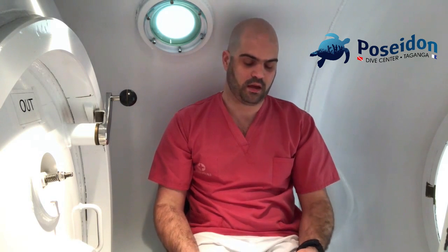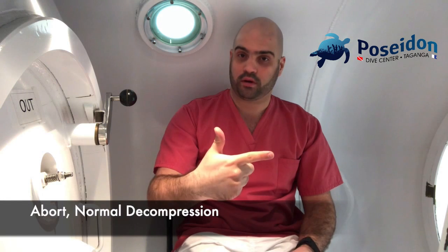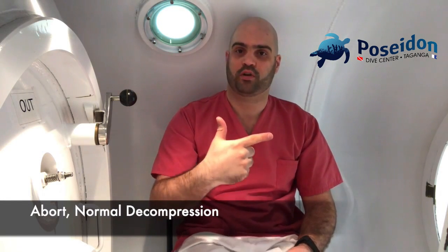Of course, we can have the situation where you need to go very quick to the surface, or you have to abort the session, but not that fast. So you can do your safety stop, you can do your decompression stop, and you can, let's say, follow the recommendations on the ascent speed. So this is the sign for abort any session, but with a normal decompression procedure. Okay.